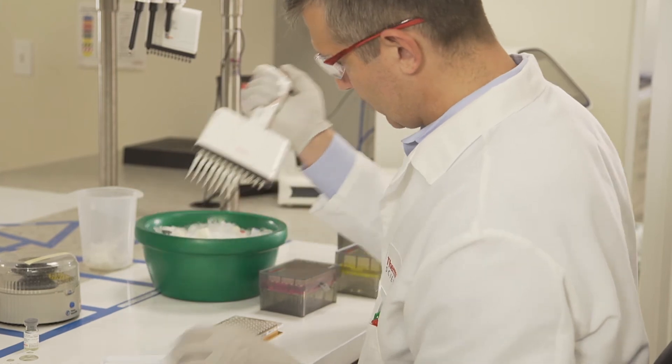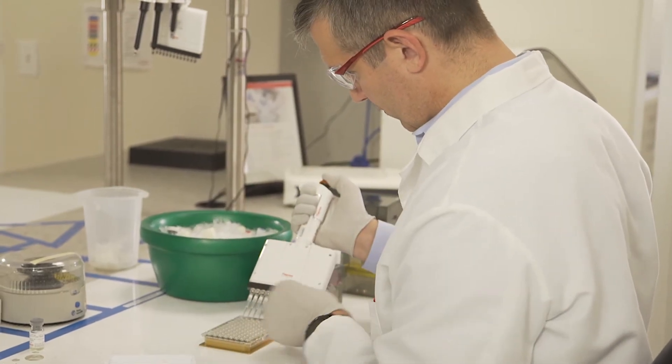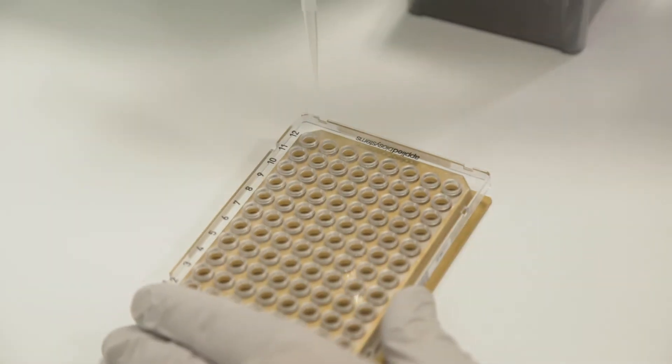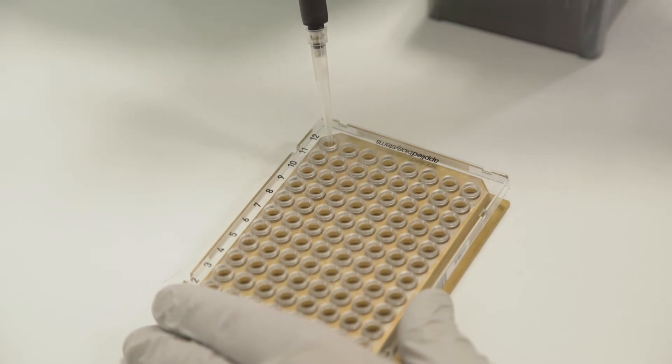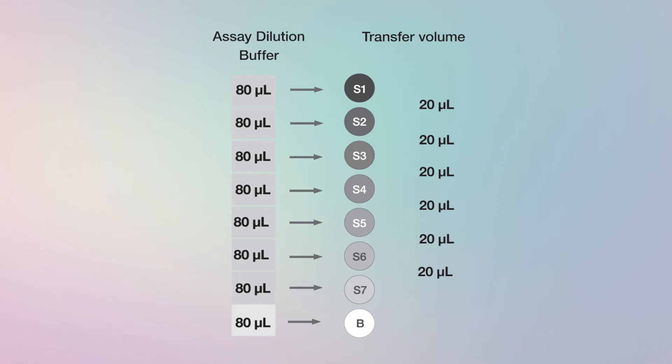To create your standard curve, add assay dilution buffer to each well. Then add the reconstituted protein to the S1 well. Continue to serially dilute the protein, making sure to change pipette tips in between. Remember to include a background well.